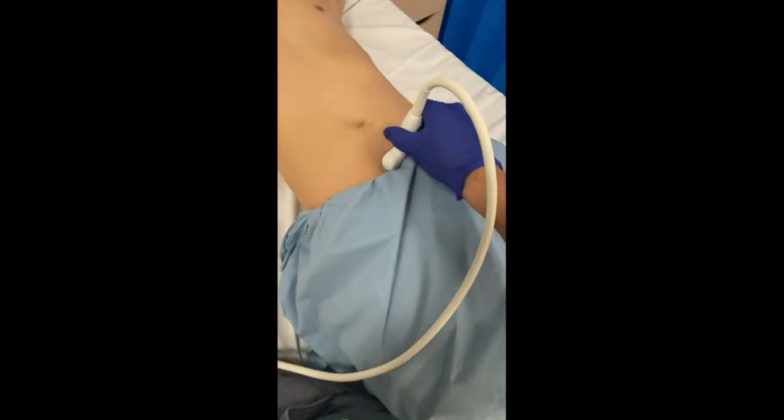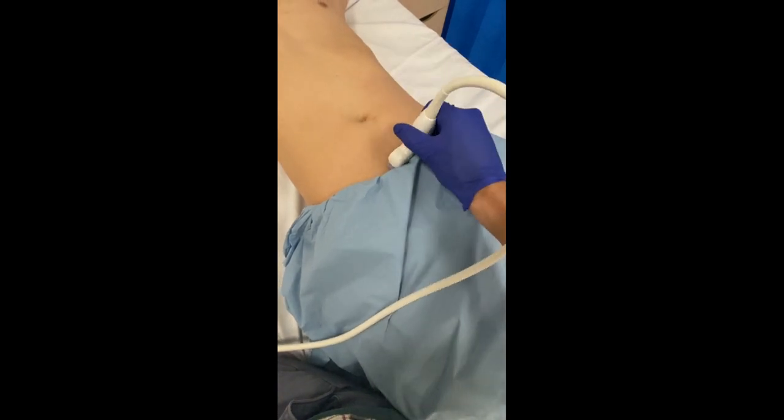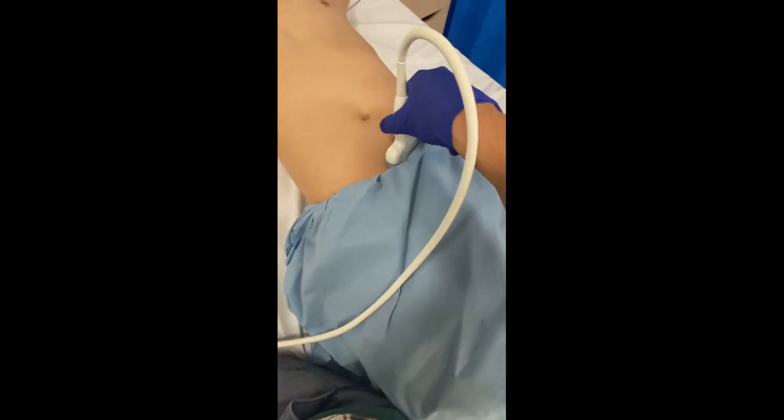The probe should be placed on the lower abdomen over the suprapubic region with the probe marker facing towards the patient's right. The probe can then be fanned through the entire bladder in order to identify any free fluid.